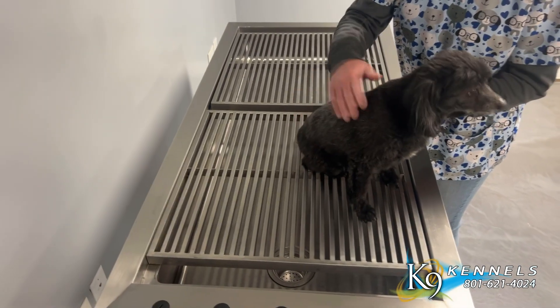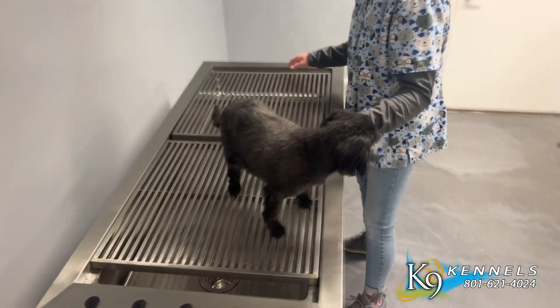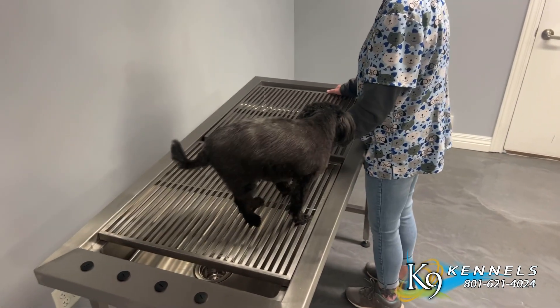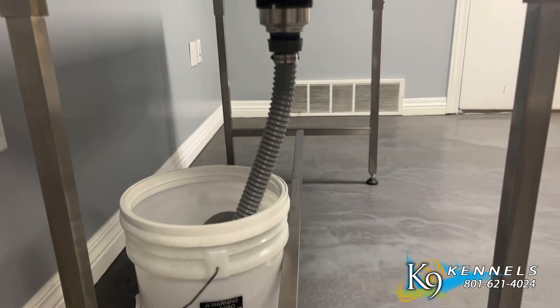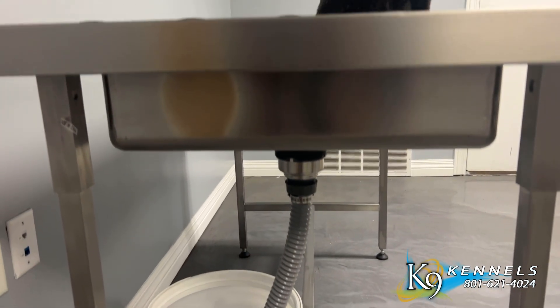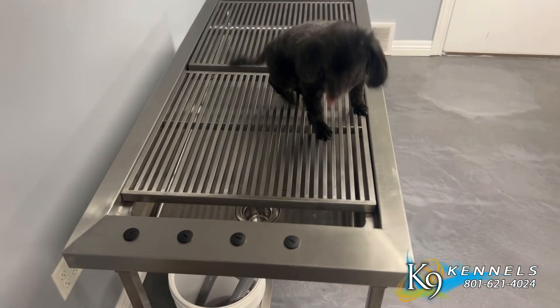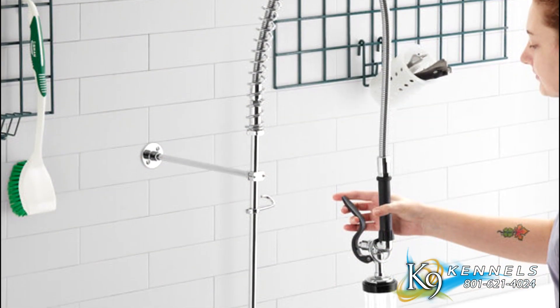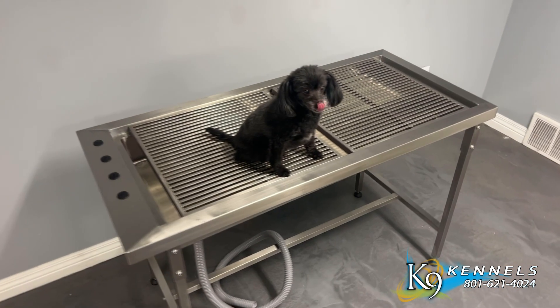Crafted from 100% stainless steel, this table is exceptionally durable and suitable for use in any area, making it a reliable choice for veterinary clinics, grooming salons and more. Designed with convenience in mind, the Omnipro Tub Table features pre-drilled holes for easy installation of a faucet and spray head, allowing for seamless integration of water supply for dental or other procedures that require water usage.